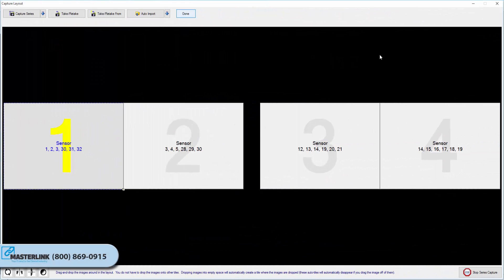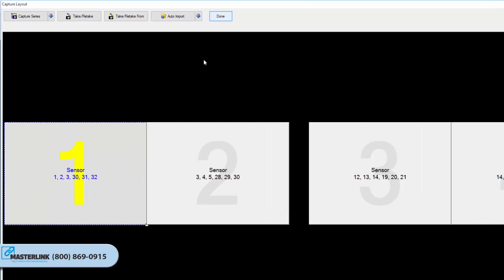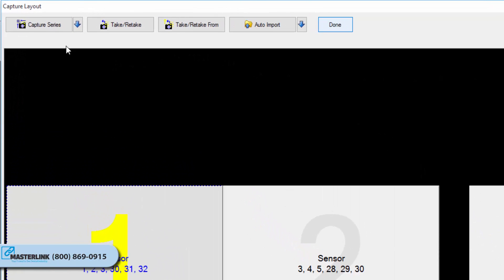The Layout Capture Window contains several different functions that can be used to add and manipulate images in layout tiles. This portion of the guide will provide an overview of these options.